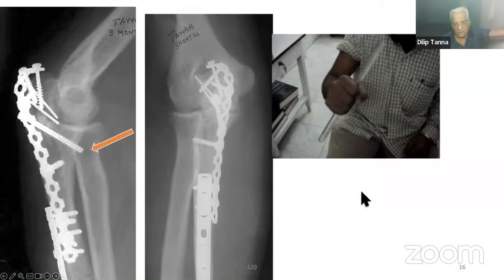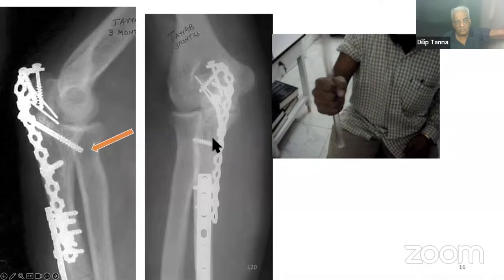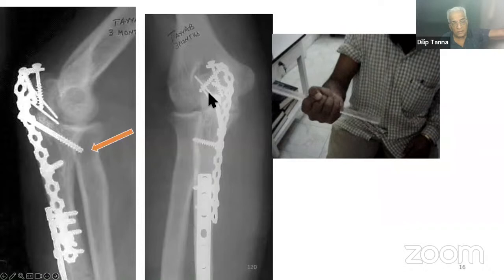All you do is, this is the main screw. Put in a lag screw here. Then the other things are neutralizing. Once you have put in this lag screw and fixed it perfectly well, you have only to neutralize the rest and then it will be fine. As you can see, these are only the K wires doing the job, or probably very thin screws.